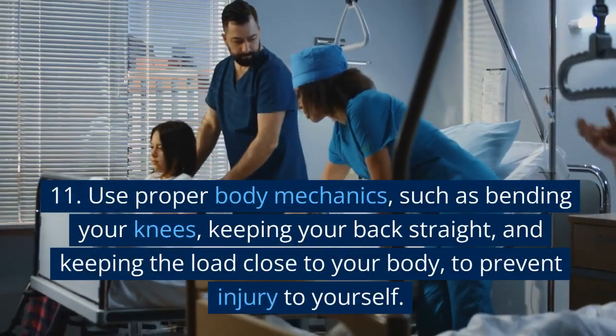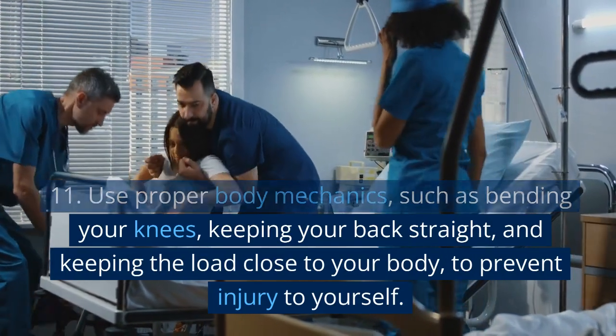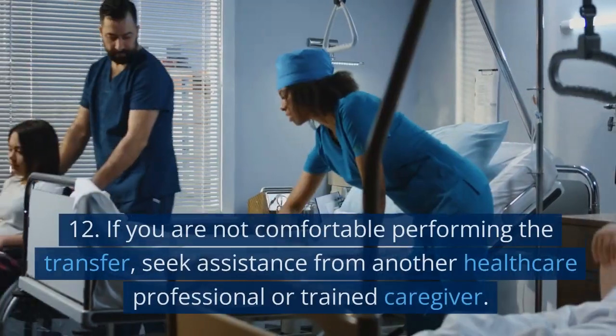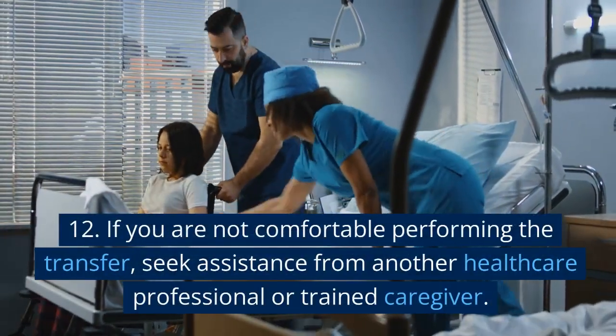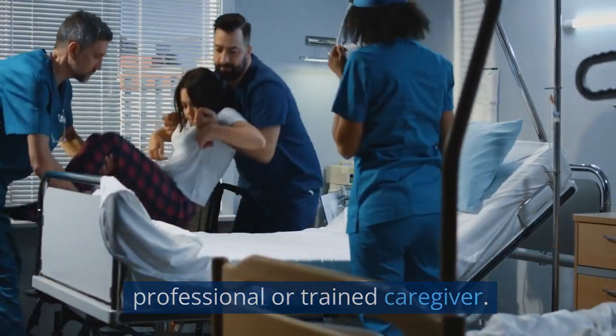11. Use proper body mechanics, such as bending your knees, keeping your back straight, and keeping the load close to your body, to prevent injury to yourself. 12. If you are not comfortable performing the transfer, seek assistance from another healthcare professional or trained caregiver.